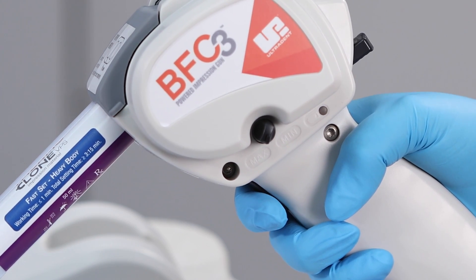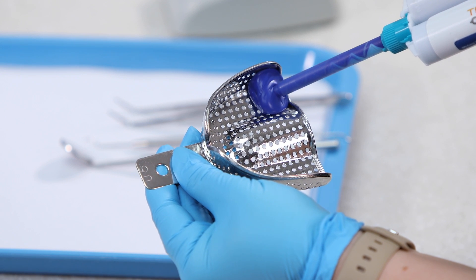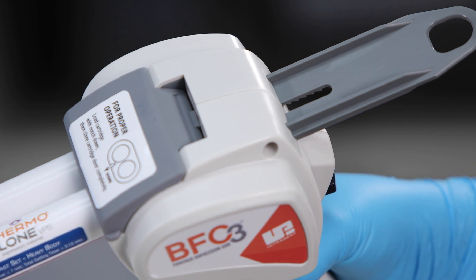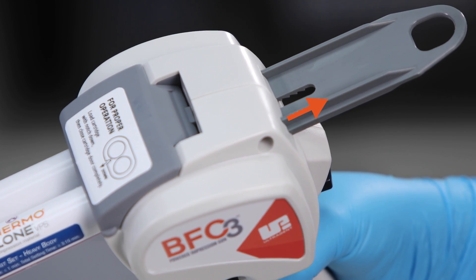Press the trigger to begin dispensing material. To eliminate dripping, the BFC3 plunger will reverse direction momentarily once you release the trigger.